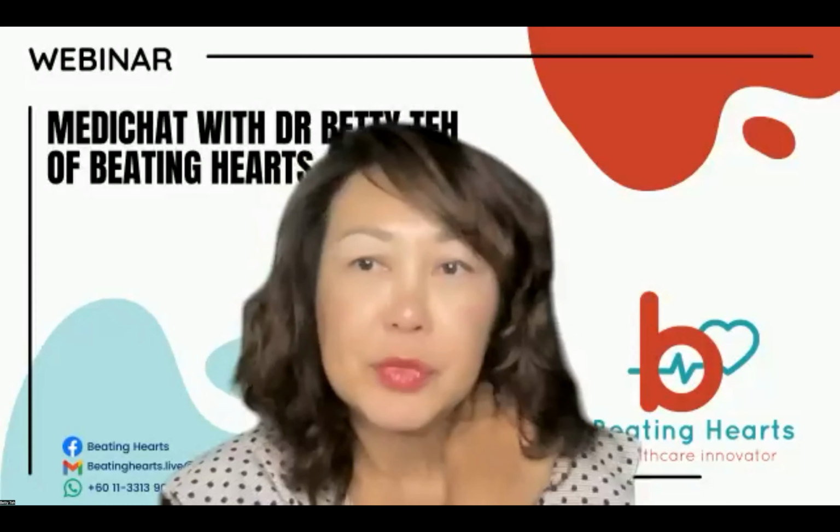Oh, don't worry. Okay, can I ask you about this mitral valve, right? When they put in the mitral valve, when they do the repair, they also put the ring.